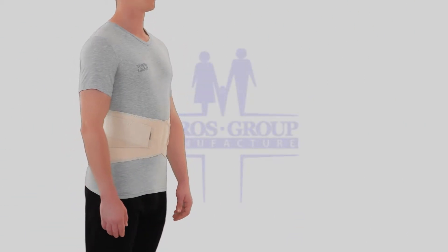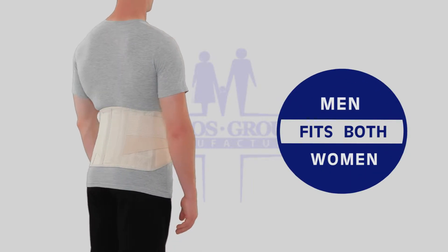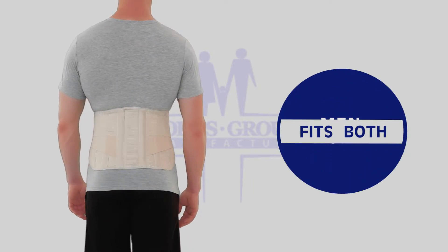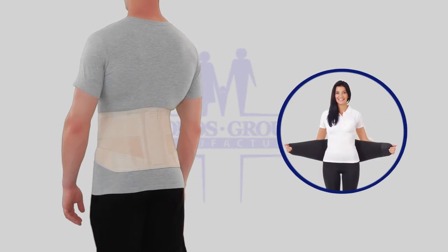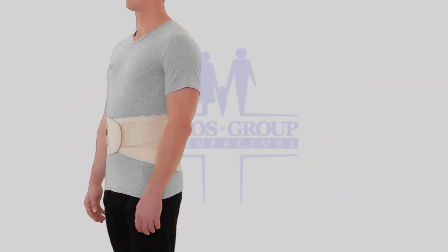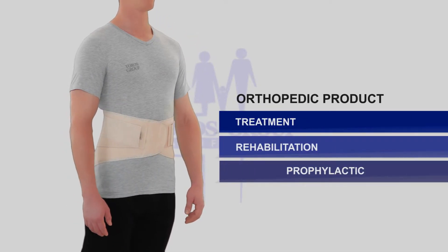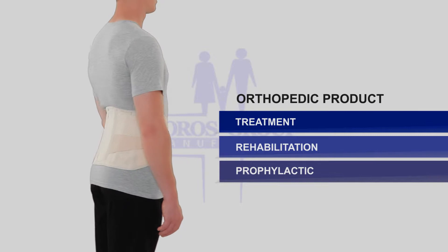Lumbar lower back brace Type 213, universal model, fits both men and women, available in black and beige colors. It is intended for rigid fixation of the lumbosacral spine, recommended for the rehabilitation period after injuries or surgeries of the spine.